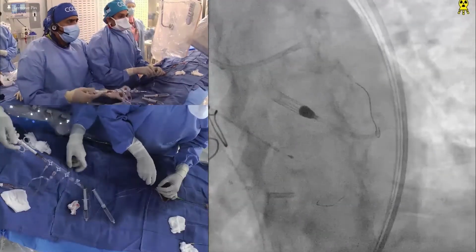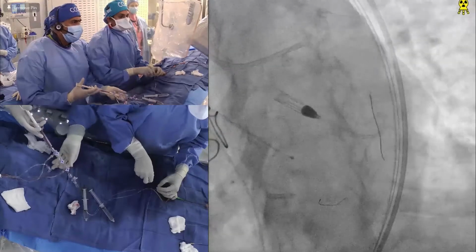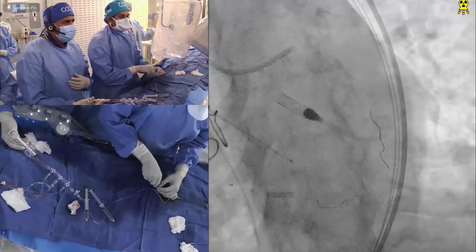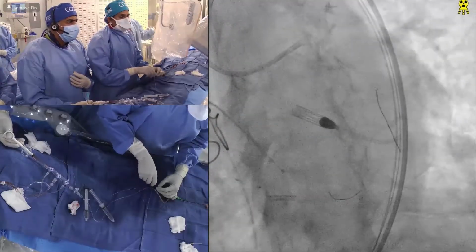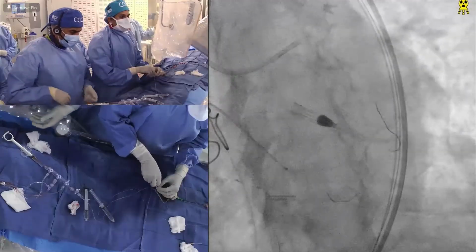So the key is, as long as you did the technique that Anu did, slow movement and advancement, we have never been stuck. Yeah, I know a lot of people say this is a common, I would not say common, myth, because there have been some cases where people have spoken that the 1.25 bar traps the most, that the bar gets stuck, but I think it may be a technique point of view also.